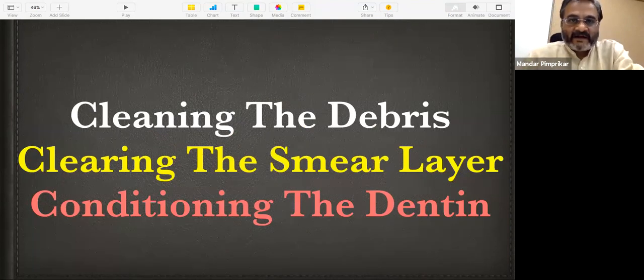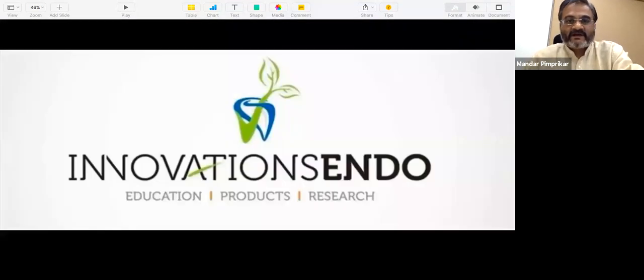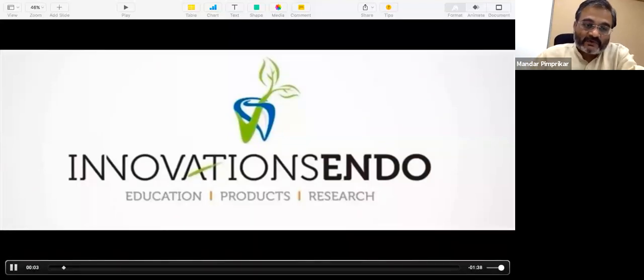So I have divided this presentation into three aspects. One is cleaning the debris, second is clearing the smear layer, and third is conditioning the dentine. So you should remember 3 C's in endodontic disinfection. So let's start with understanding why irrigation is so important.